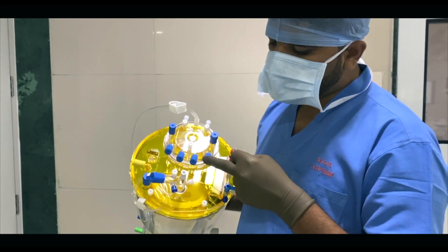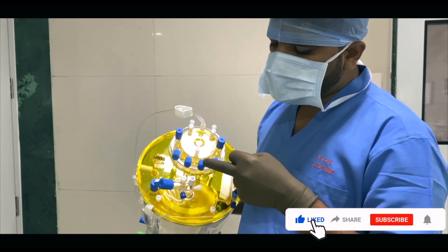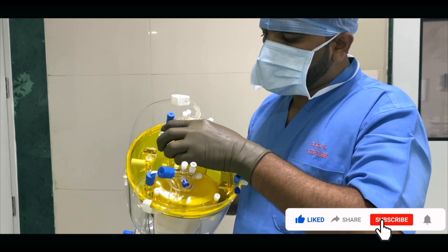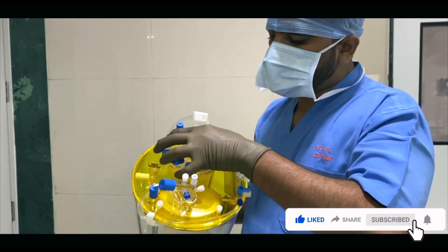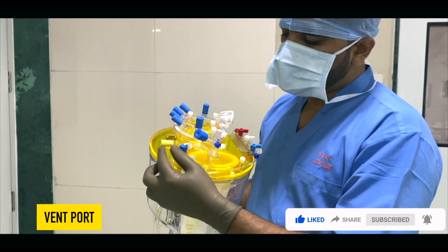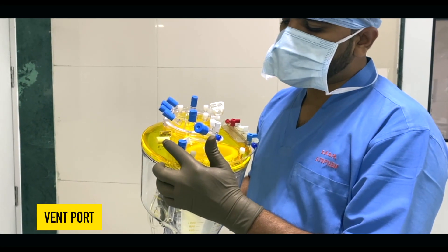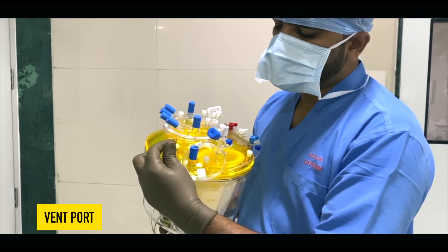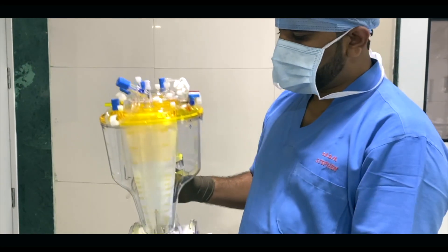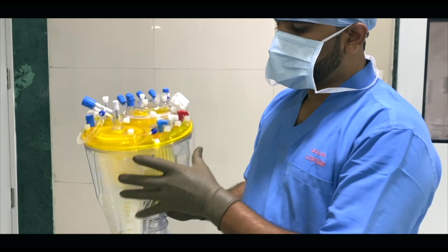These are four different ports which are useful to attach the suction and recirculation line. You can rotate these ports in any direction. Next, you can see this yellow color cap port — this is the vent cap. Please note that before starting the case you should remove this cap and open it for venting.